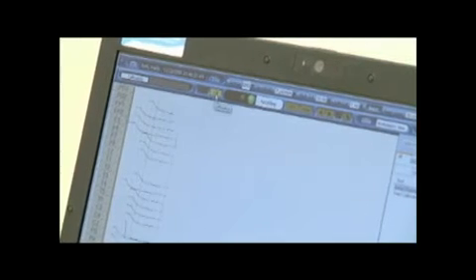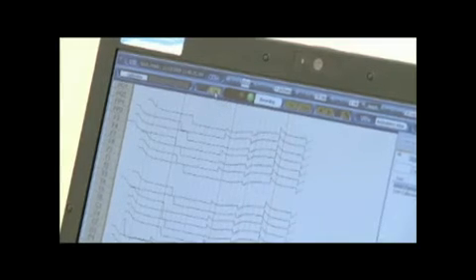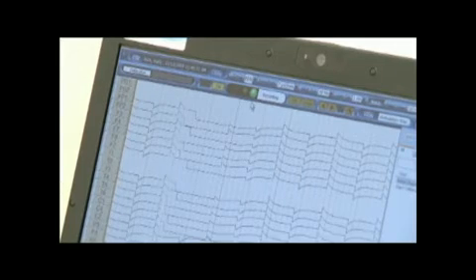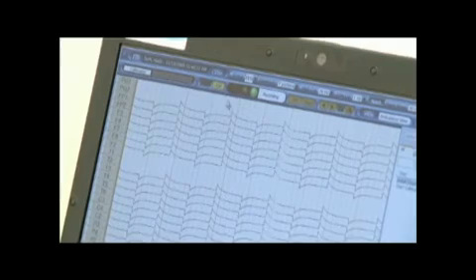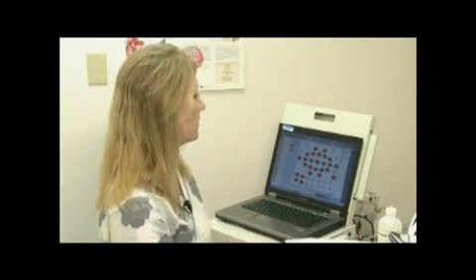This is a good time to run your calibration signal. Click on Cal and it will automatically start running. Let it run for a page or two. Then click the red button, which pauses the recording. Now click on Impedance, which will bring the impedance screen up. And now it's time to bring your patient back to apply the electrodes.